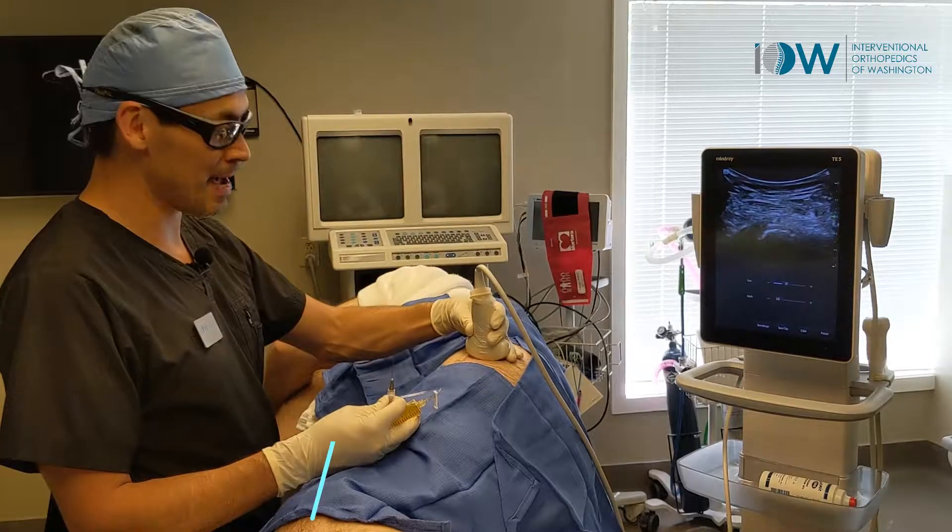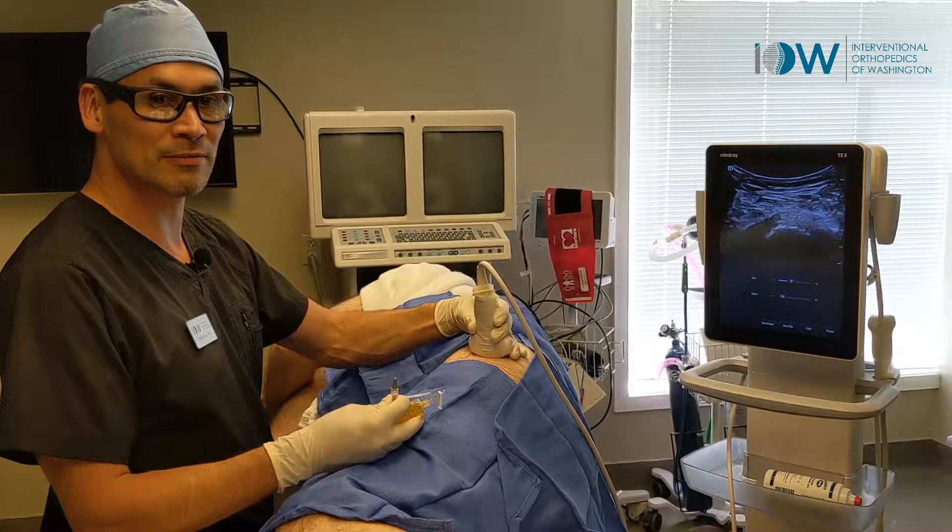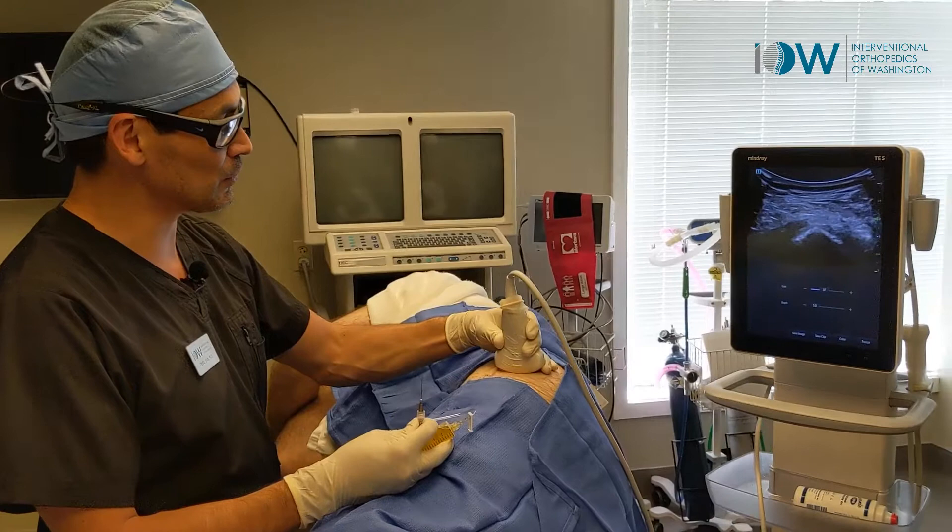Welcome back to Interventional Orthopedics of Washington. I'm Dr. Silva. We're doing a greater trochanter injection on the left side where we have some enthesophytes and calcification of the gluteal tendons at the greater trochanteric attachment. We're going to go through that under ultrasound, do some mild barbotage followed by a PRP injection.